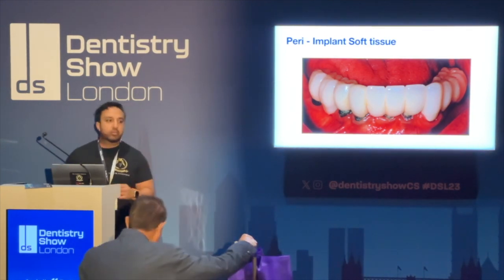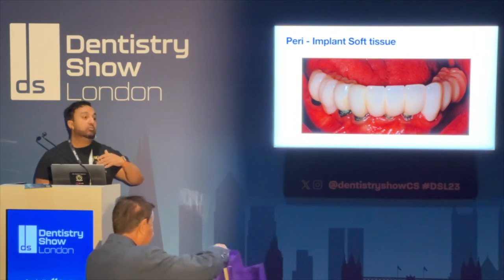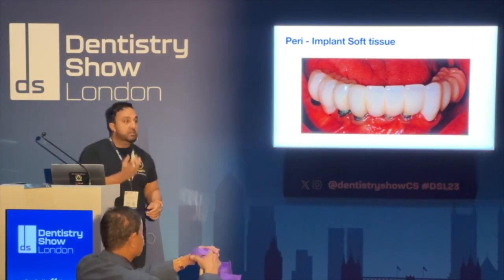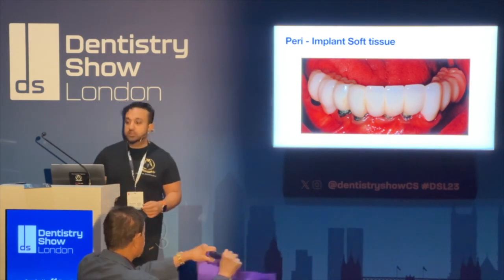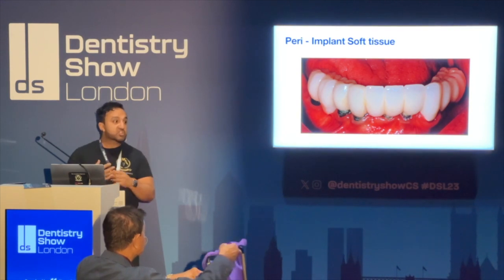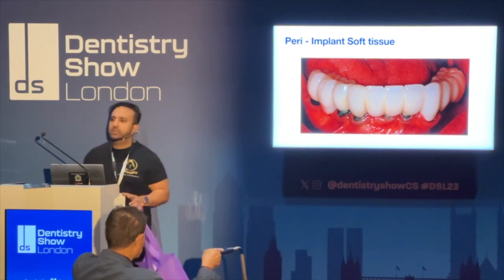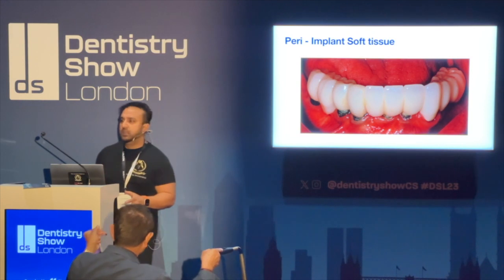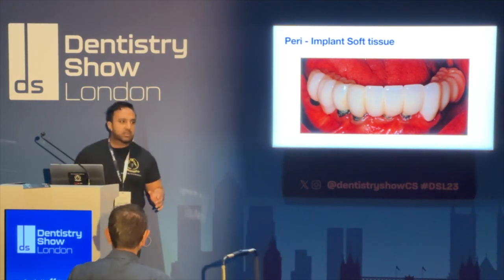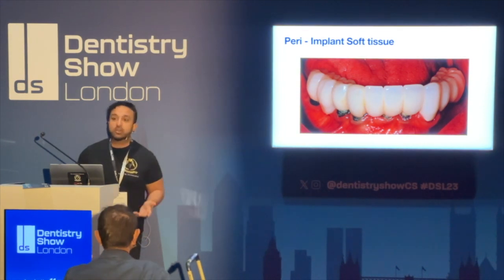Once you clean it up, what will happen is that the threads are quite rough, and they are going to be retaining the plaque in the area. So what you want to do is actually get a burr and smooth this out, to make it a smooth surface. So imagine root planing on a tooth. What do we do with root planing? We get a scraper and we remove 10 to 15 microns of the root cementum to get rid of the bugs. It's very similar on an implant.